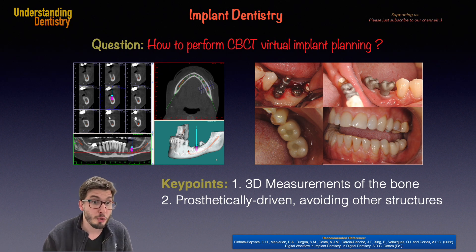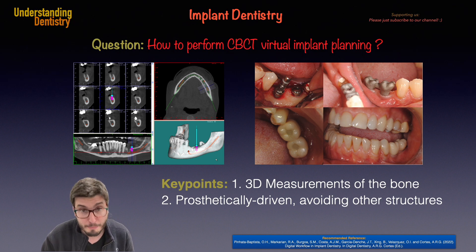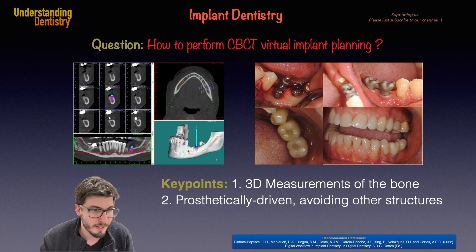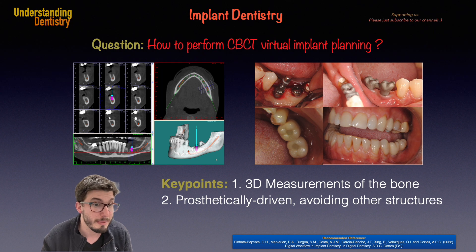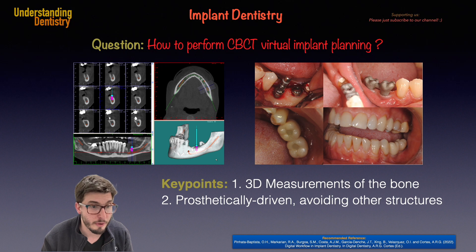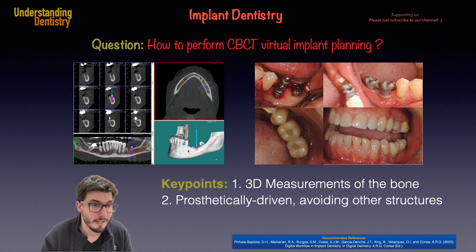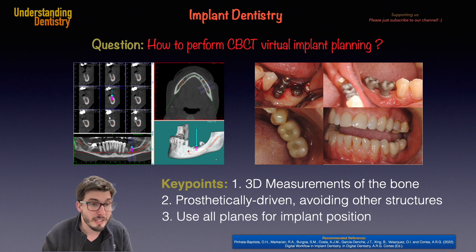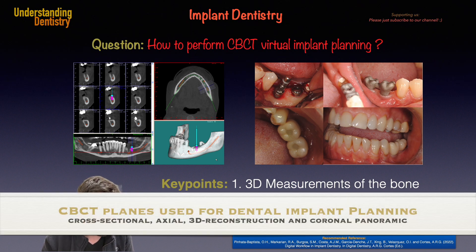Since implant planning should be prosthetically driven, we should start from a conventional or digital wax-up. It's easier if we can see the virtual wax-up superimposed onto the CBCT images. That's why it's very important to define the ideal position of our dental implant using all the planes available on the CBCT image. On the top left, you can see nine cross-sectional CBCT images.